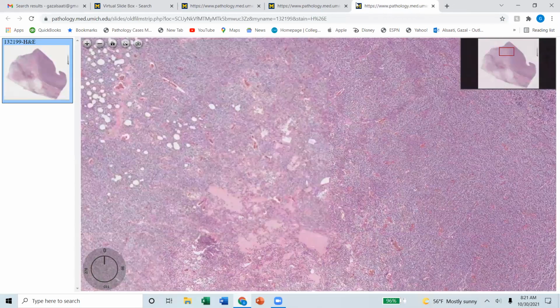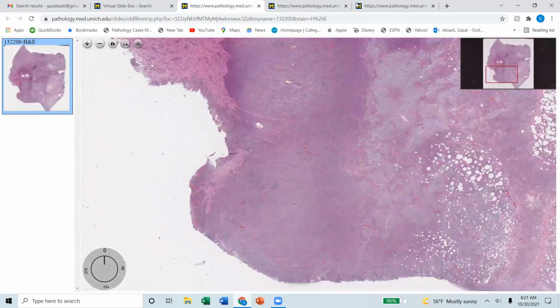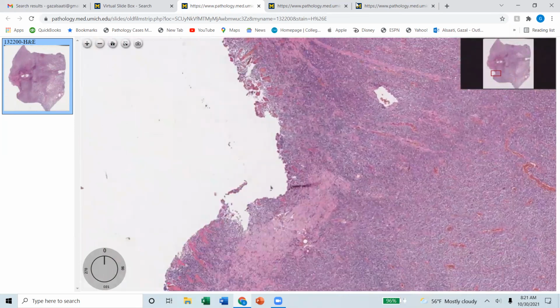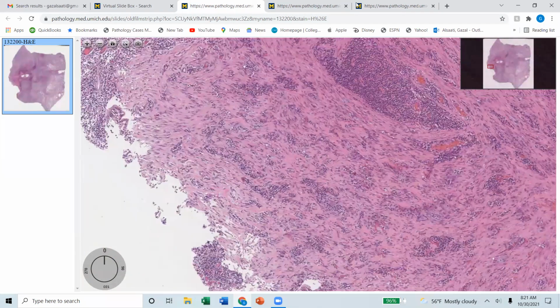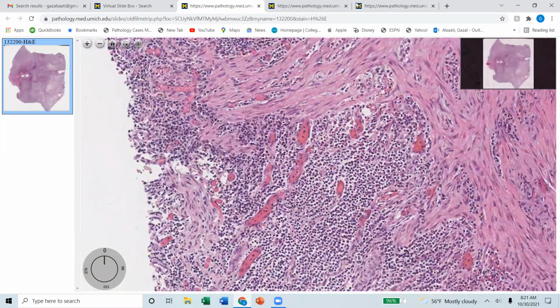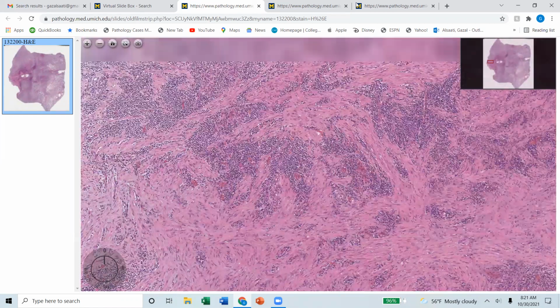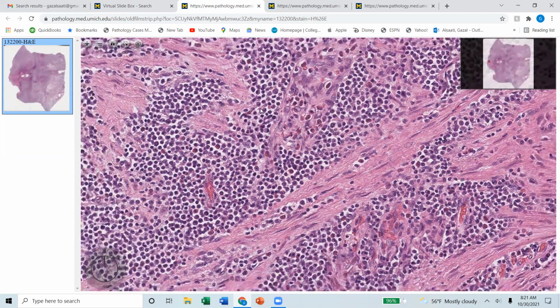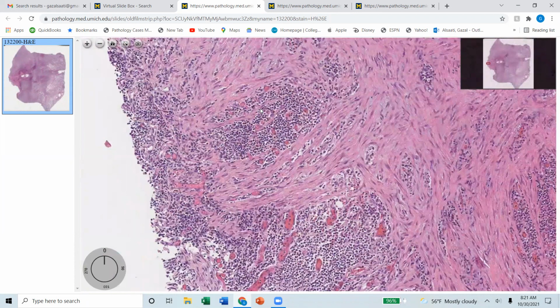Okay, so what are we supposed to see in the epithelium? It will be small monomorphic T cells, and that's why it's named monomorphic epitheliotropic T cell lymphoma. So basically it will be all monomorphic cells. Even over here you see that they're all monomorphous small cells. A nice picture of the epitheliotropism, maybe a little bit over here, it's not that great, but if they had demonstrated that, that would have been very nice.